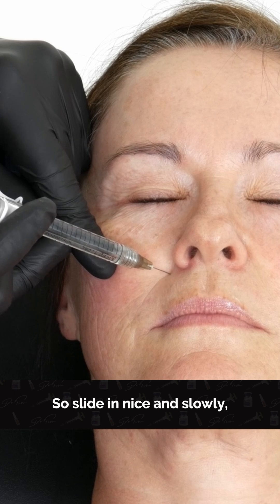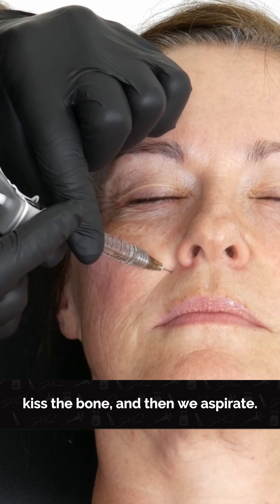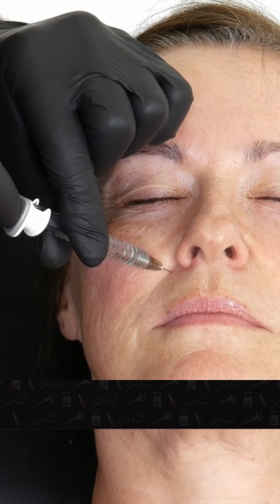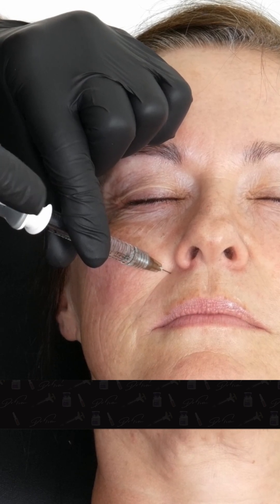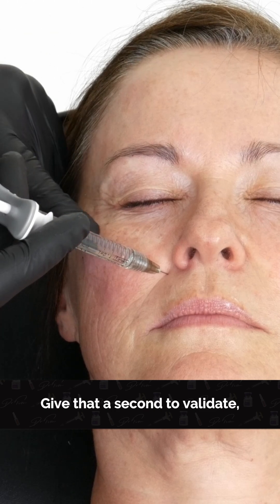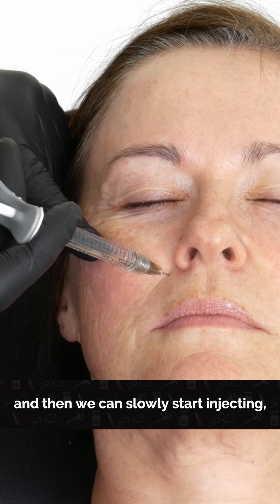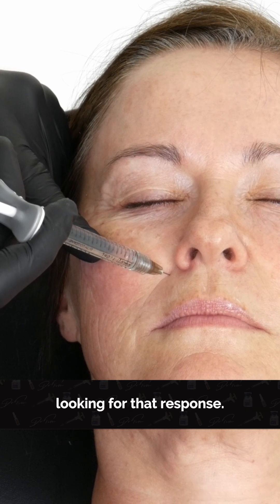Slide in nice and slowly, kiss the bone, then we aspirate. Give that a second to validate, and then we can slowly start injecting, looking for that response.